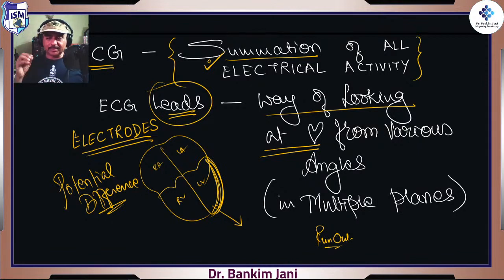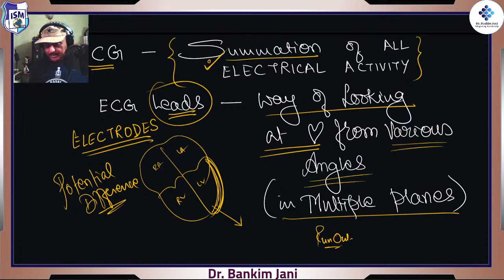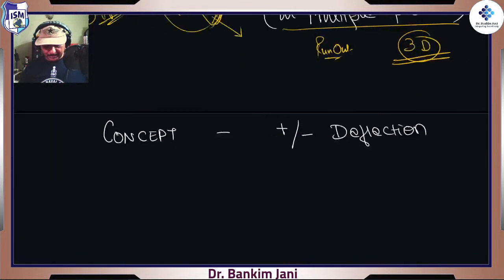In order to understand the condition of the heart, you have to watch the heart from different planes, different levels, from various angles in multiple planes, actually in 3D. Yes, in ECG you watch the heart in real time in 3D. So everything would be clear with all those simple lines. Let's see.